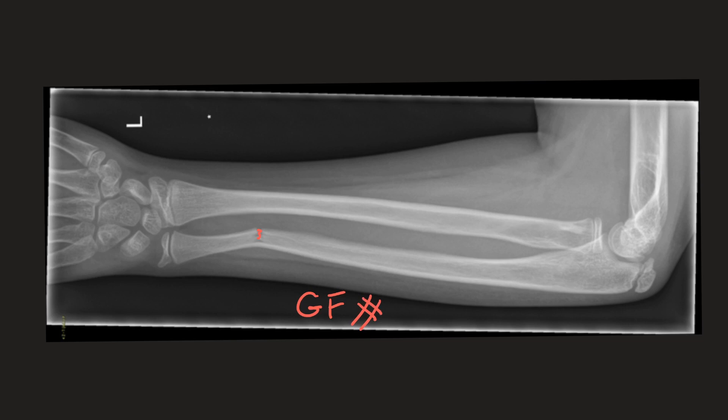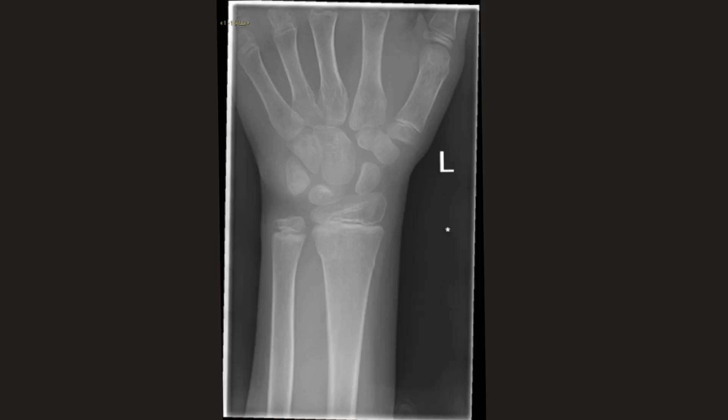In the second case, on this wrist x-ray, you can see that the distal radius looks abnormal. There are subtle irregularities in the cortex, and this is due to an axial loading injury, in keeping with a torus or buckle fracture.